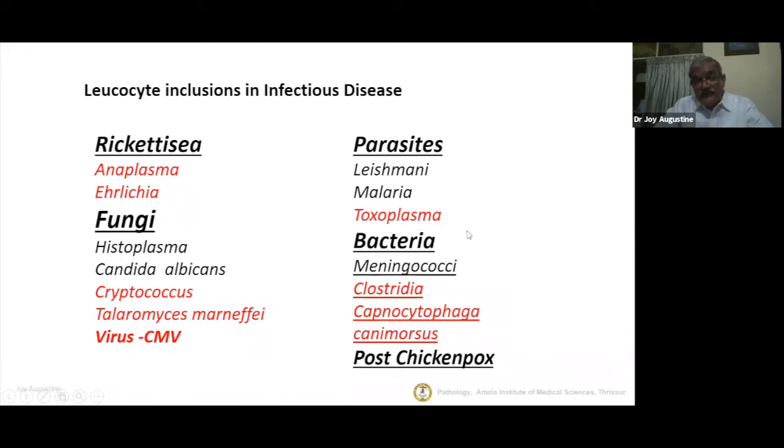Toxoplasma, you may. But the others are not. This is a specific organism which is seen after dog bites. This is seen in the saliva as a normal commensal of the dog's mouth, and then sometimes it can cause serious septicemias. And there are certain post-splenectomy findings which will show that this is something. The ones marked in black here like this, some of them we have seen.